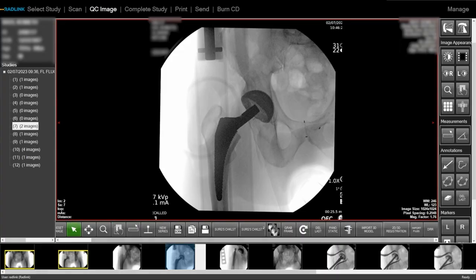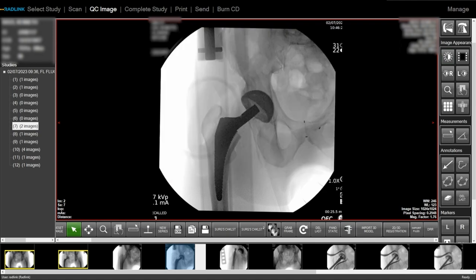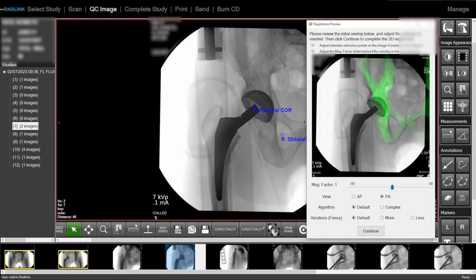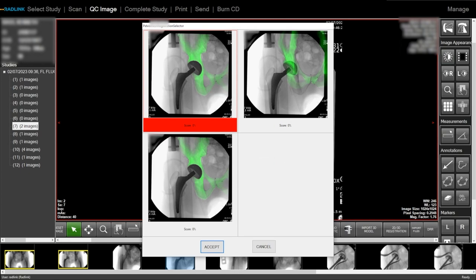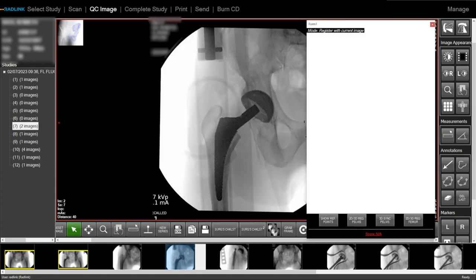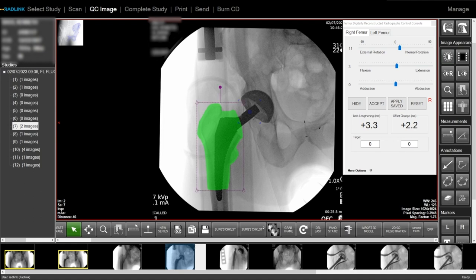This is just another way to measure using a single overlay with the 3-2-3 software, where we can use a preoperative CT scan to create a three-dimensional model of the femur, overlay that to account for flexion-extension, abduction, and internal and external rotation, and really get an optimal overlay. You can see with the trial six high plus five head, I'm a little too long — about 3.3 millimeters long and a little too much offset. So I think I'm going to be good when we go to putting the six high in and dropping down a ball length.